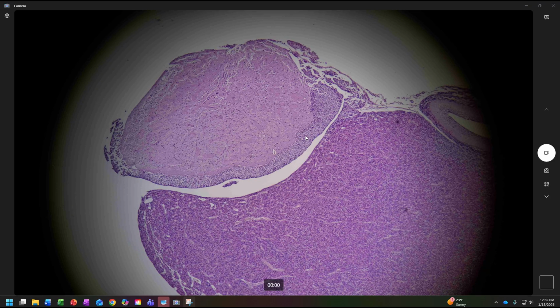Now, within them, we're not going to talk about this, but I just want to validate this idea of seeing things that are visually distinct from each other. If we look at this lighter area, we see a light purple core, and then this outer layer that's a little darker purple, kind of a little more grainy. We're not worried about naming that, but that's what I mean by visually distinct regions. So let's back up and look at the two big ones here.